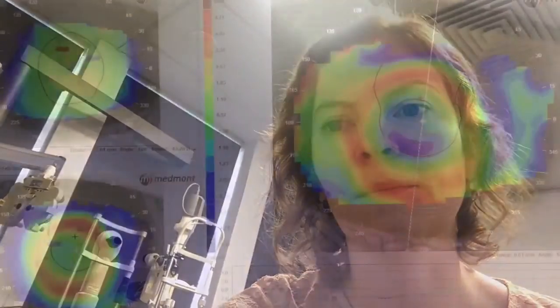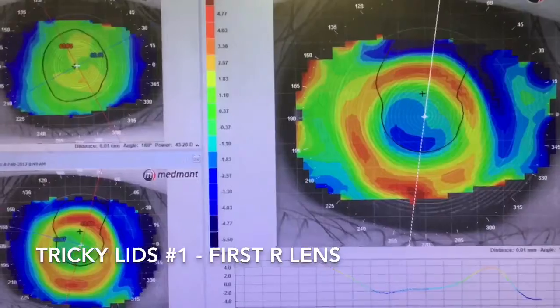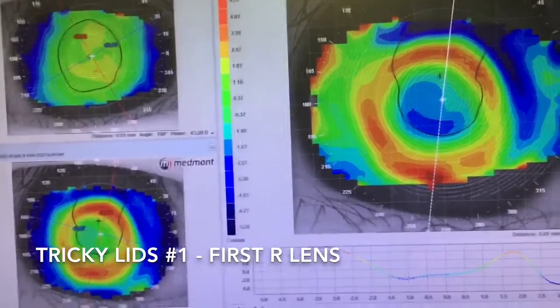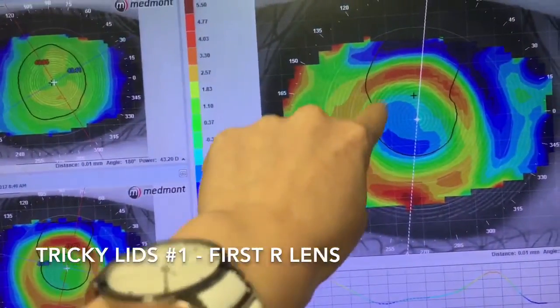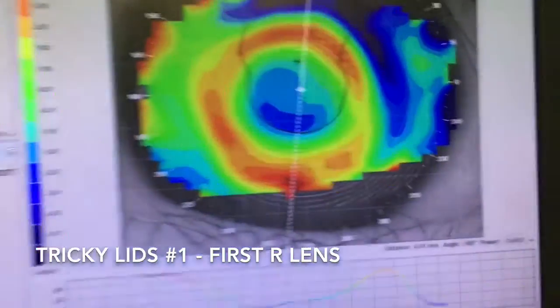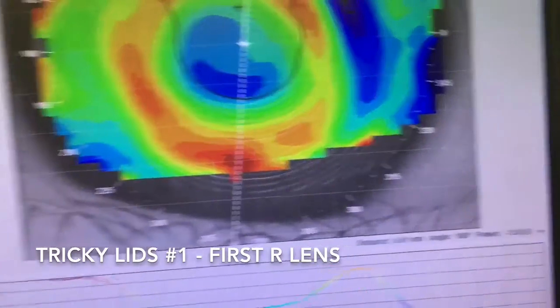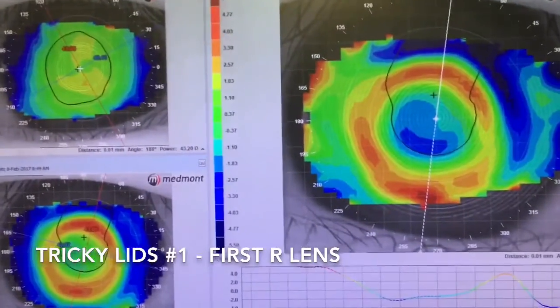I'll show you her maps. She's minus 3.25, so we're shooting for about 3.25 to 3.75 diopters of treatment, and this is a lens that we've designed. You can see there's a little bit of inferior decentration of the lens, and that's likely because of lids. Right at the apex we've got only 1.50 diopters of treatment despite being minus 3, so we're just not getting good acuity out of this.